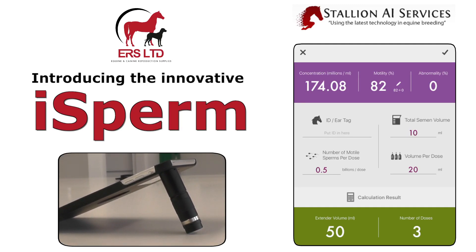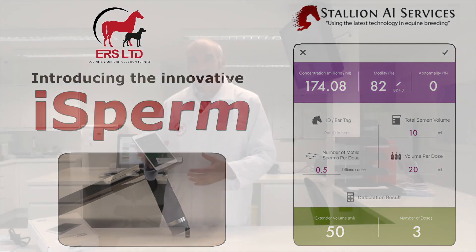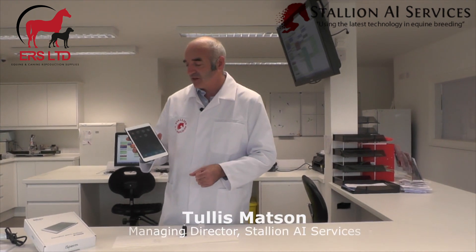I'd like to introduce this new product we're just about to launch. It's called the iSperm and it's for analyzing semen — the motility and the concentration of equine semen. It can do bovine and porcine as well.